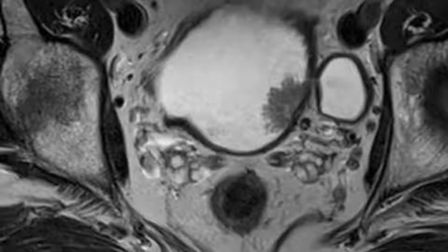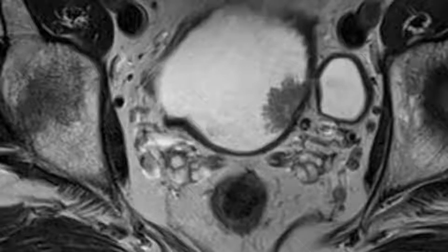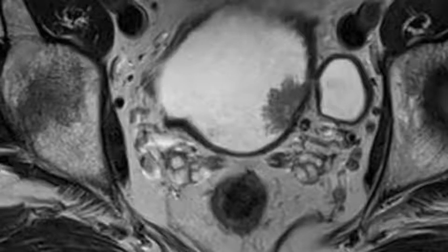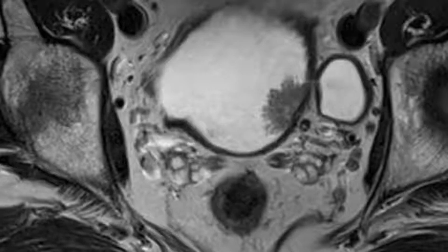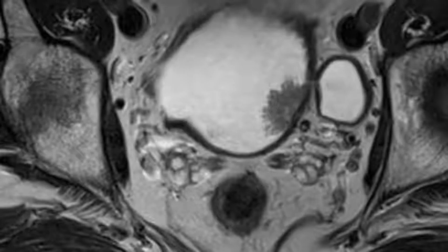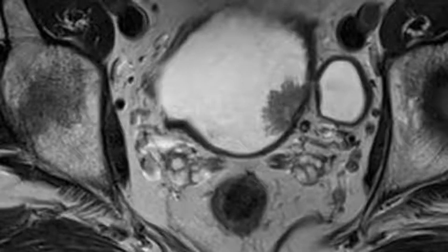Positron emission tomography. Positron emission tomography with 2-fluorodeoxyglucose is considered to be of lesser value in the local staging of bladder cancer due to urinary excretion of the radiotracer. A study of 55 patients with bladder cancer that was performed to evaluate the usefulness of PET-CT in preoperative diagnosis of metastatic disease found a sensitivity, specificity, positive predictive value and negative predictive value of 60%, 88%, 75%, and 79% respectively.